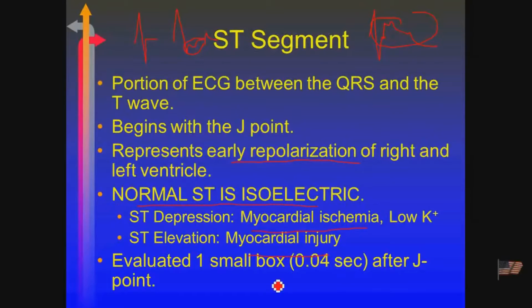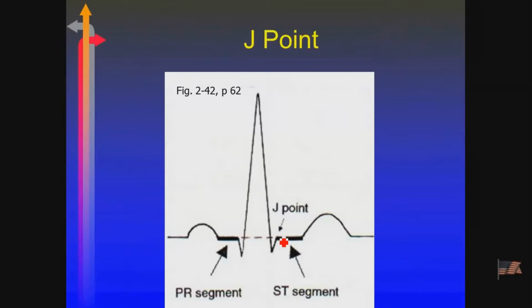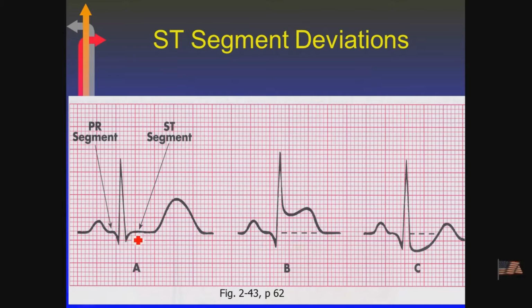So we look at where the ST is, elevated or depressed, one small box after the J point. The J point is right there. I then look over one box and say, is that level? Is it elevated? Is it below? Let me give you an example. Here's my ST segment, here's my J point. One small box over, what do you think about the ST segment at that point? It's level, right? So there's no ST elevation or ST depression.